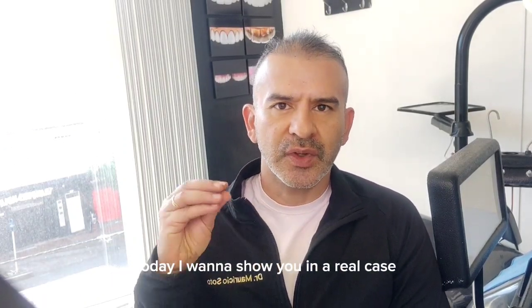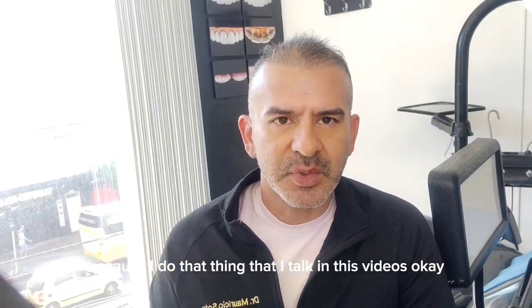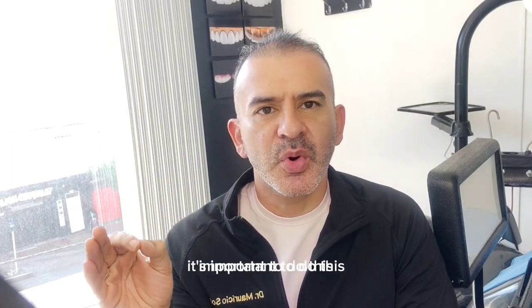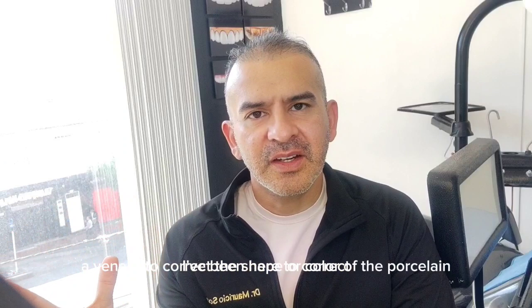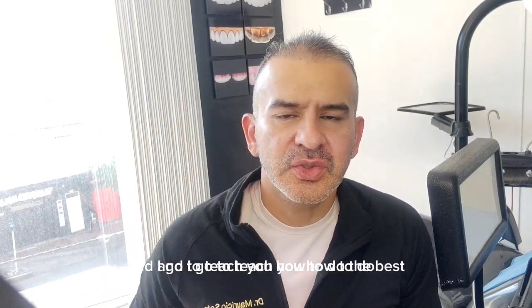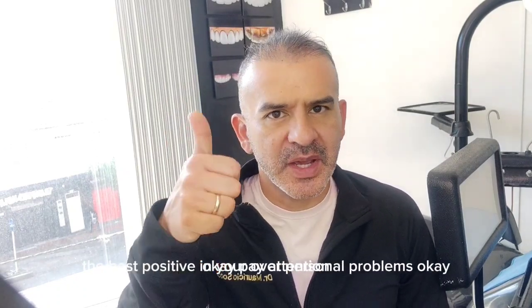Today I want to show you a real case. I like to do it this way, in a real person, because I do the things that I talk about in these videos. I want to show you how to do a composite veneer over porcelain. It's important because many times people with crowns want or need a veneer to correct the shape or color of the porcelain. Pay attention and I will teach you how to do the best composite veneer over porcelain crowns.